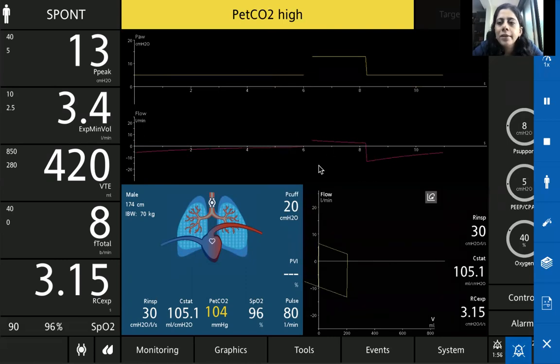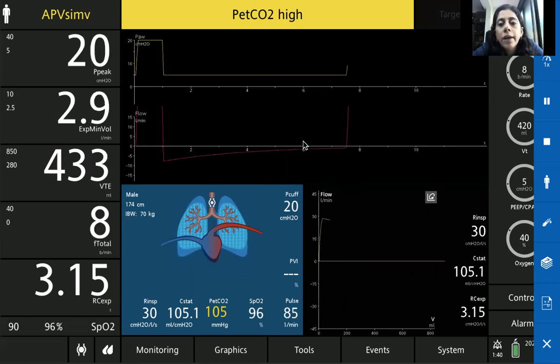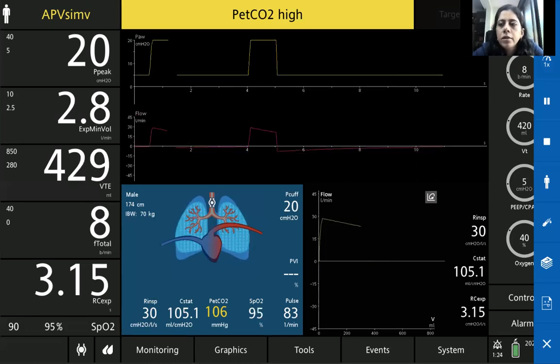So again, 3 important points. One important point is to have an expiratory trigger sensitivity which is kept higher, about 40 to 50%. Second, we have to give a pressure support decent enough to allow a tidal volume of 6 to 8 ml per kg only and not higher. And the third point is that we give them an extrinsic PEEP up to 60% of the intrinsic PEEP to help them decrease their work of breathing to generate an effective trigger.